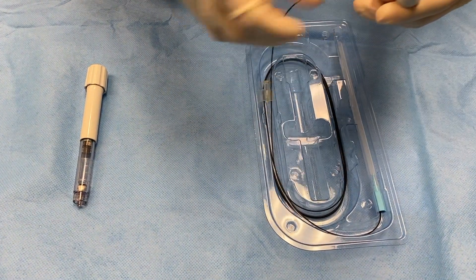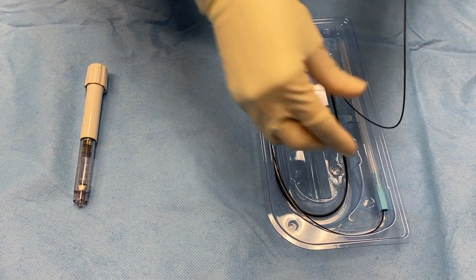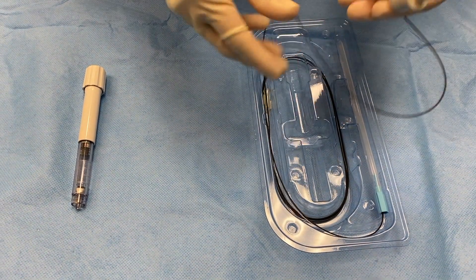Unwind the black fiber optic cable, ensuring that the lines are not tangled or knotted, and lay to the side of the tray.